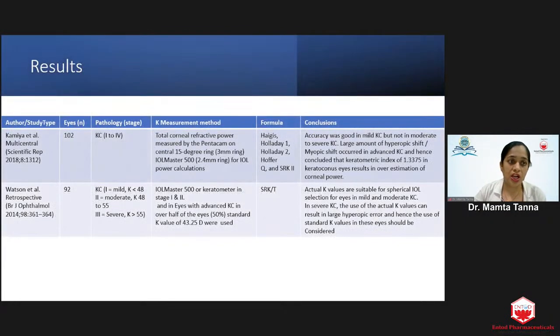Results: Kami et al. performed a multicentric study, which was the largest, including 102 eyes. The keratometry measurement method used was total corneal refractive power measured by Pentacam on the central 3 mm ring, and IOL Master for IOL power calculations. These were the formulas used for this study.